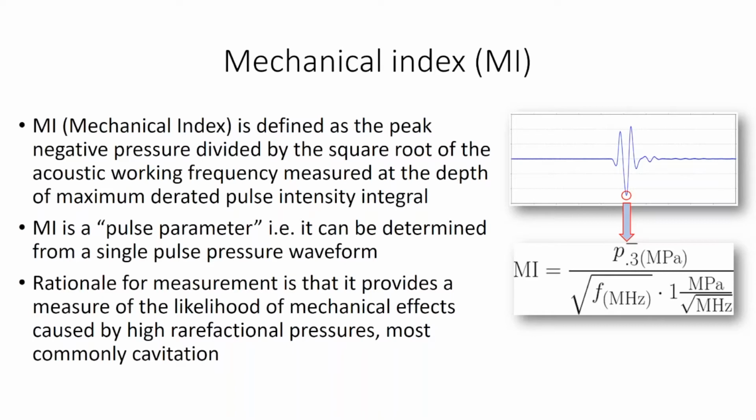I believe it's also worth noting that I have personally severely damaged some hydrophones in our laboratory when the gas content in the water we used for measurement was too high, and we measured peak pulse pressures that were only a little bit in excess of those used clinically.